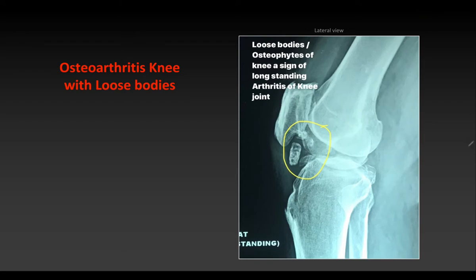Loose bodies may also be seen in the joint space in chronic cases of osteoarthritis.